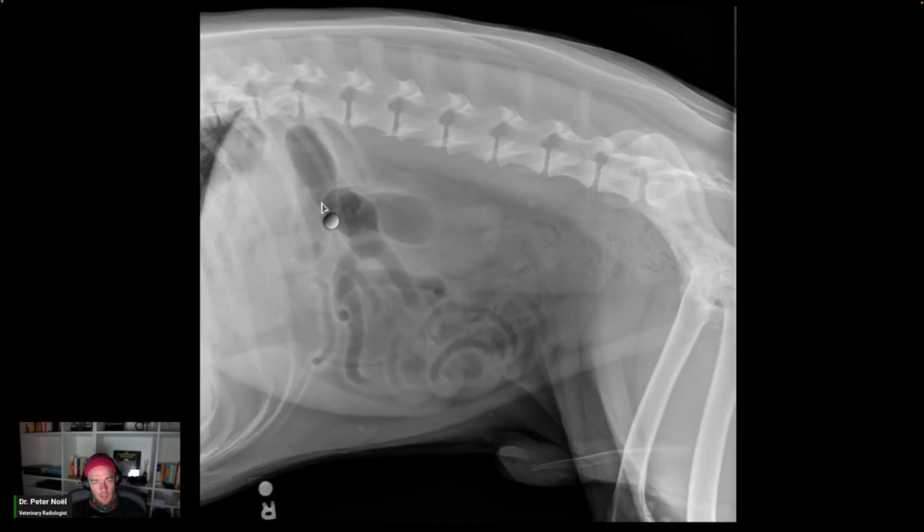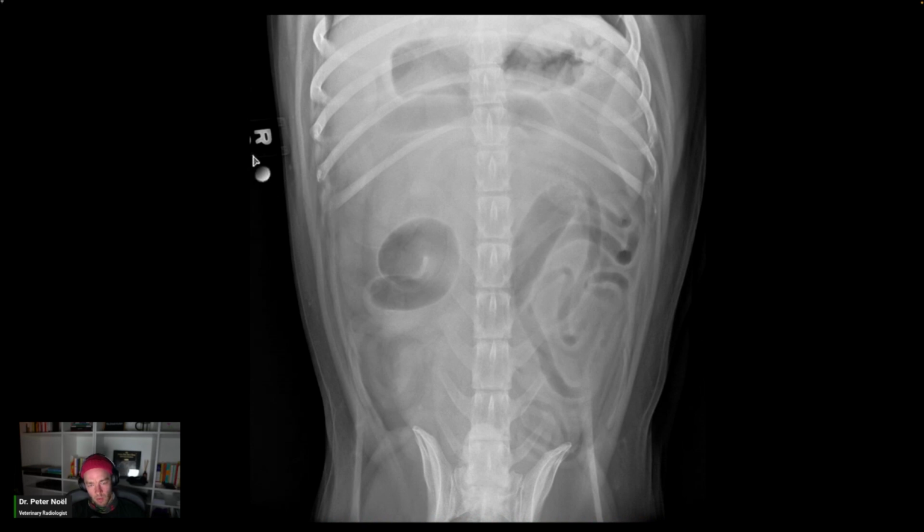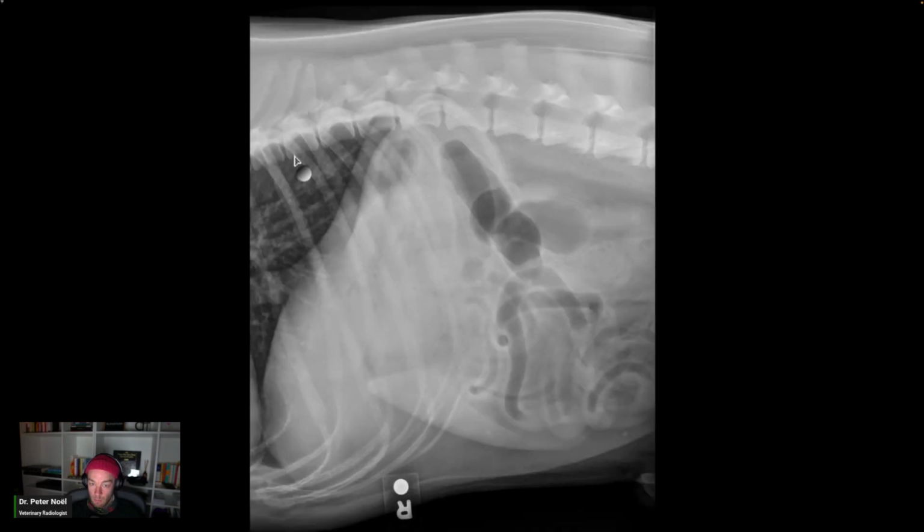I don't really see it. And would I be surprised if it's normal and hiding under here and just obscured by the gut? I think there's a likely chance. It's probably right here, caudal border, but I'm not going to lie to you and say that, oh, I see it clearly. The cranial border is often effaced by the caudate process of the caudate lobe because there's both soft tissue, you lose the border.